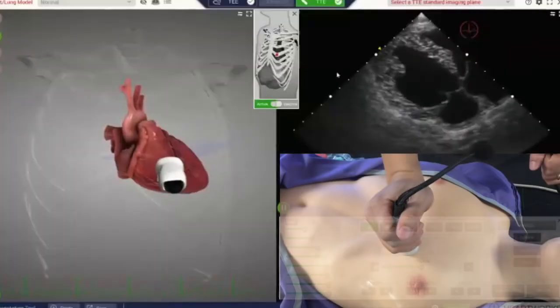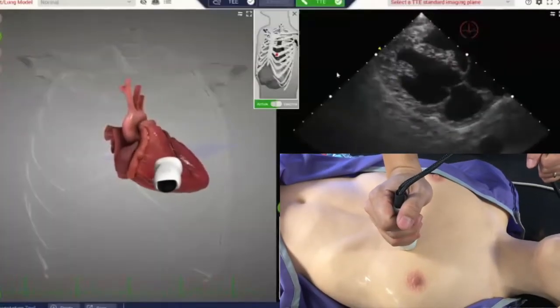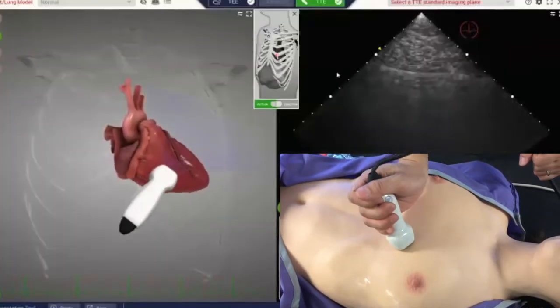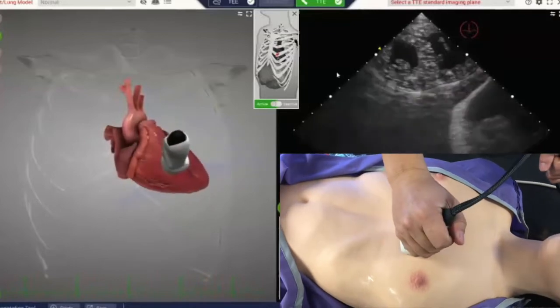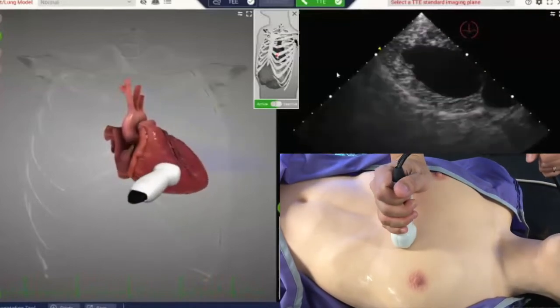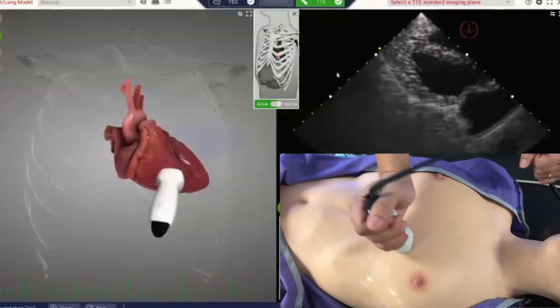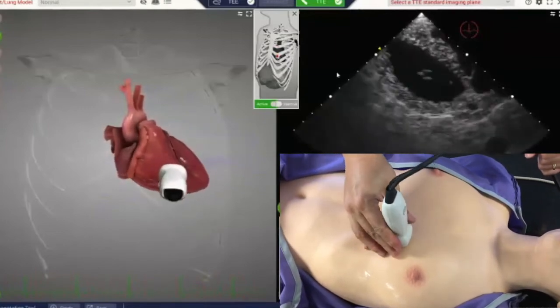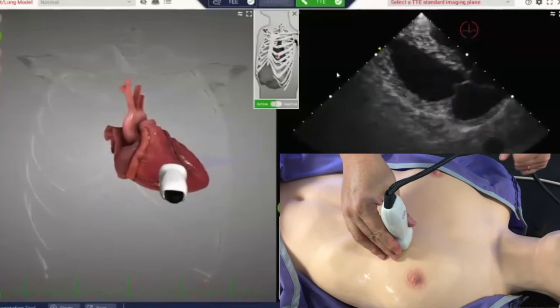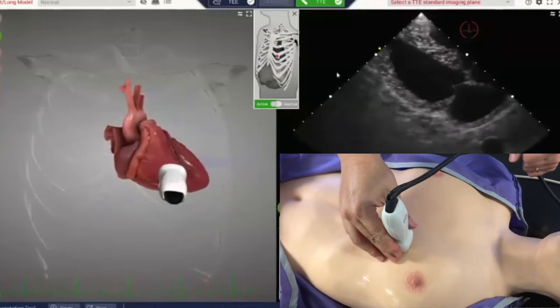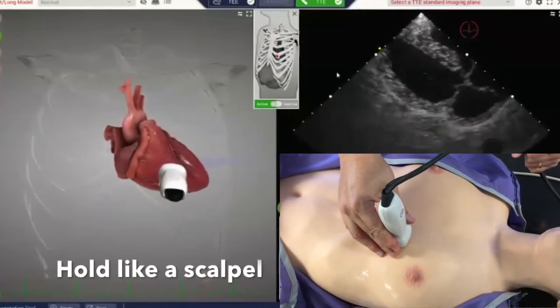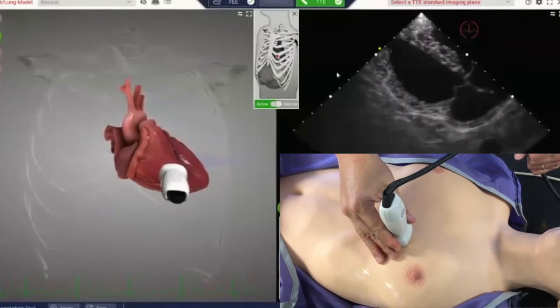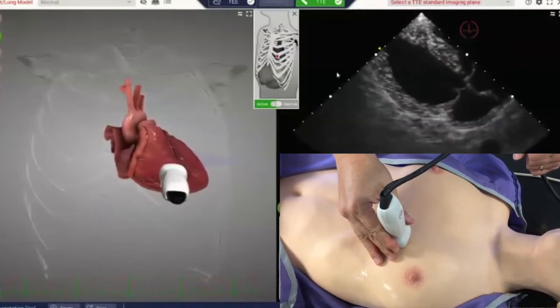How you hold the probe is crucial in echo. What might be good for flying a 100 million dollar jet is simply horrible in echo — you just have poor control. There are so many intricate structures like valves and chambers that are sometimes millimeters apart, and you just don't have the precision to examine them with a loose grip. You need surgical precision, and that means holding the probe like a scalpel, close to the transducer head, with your hand anchored to the skin surface.